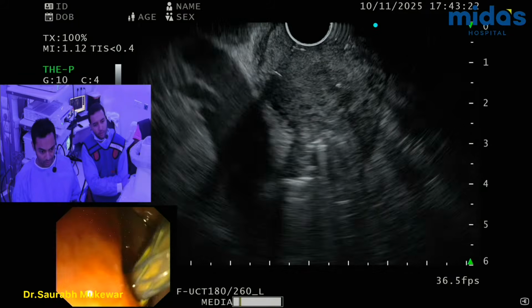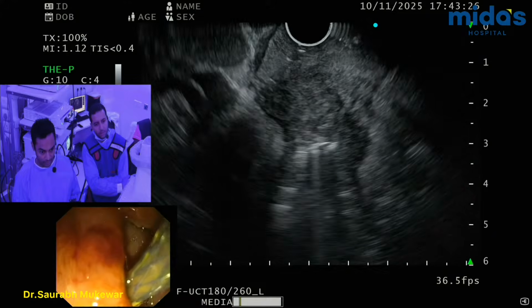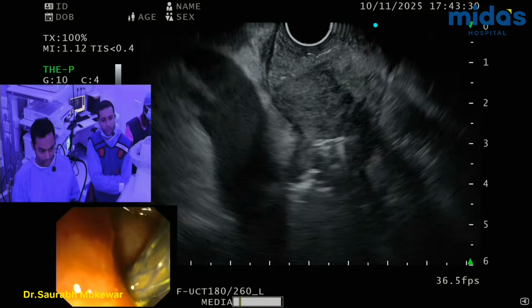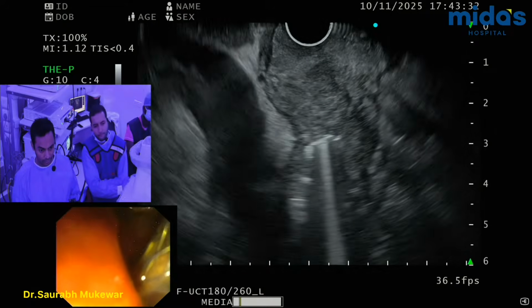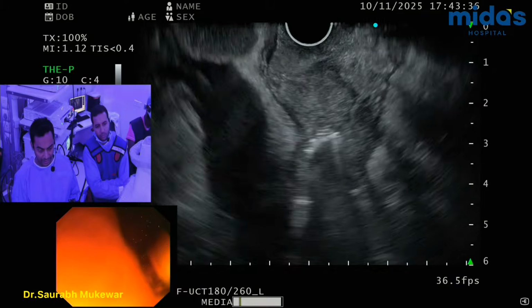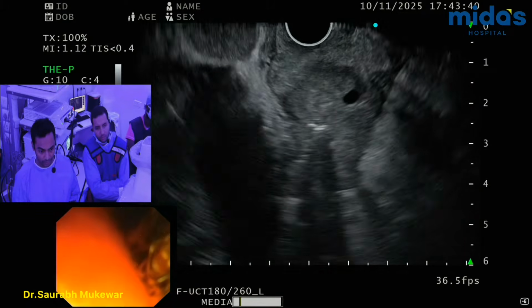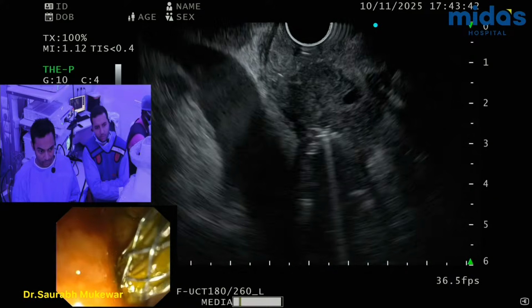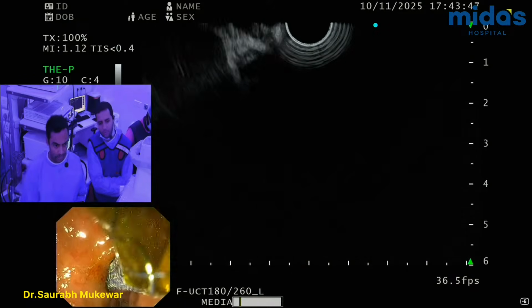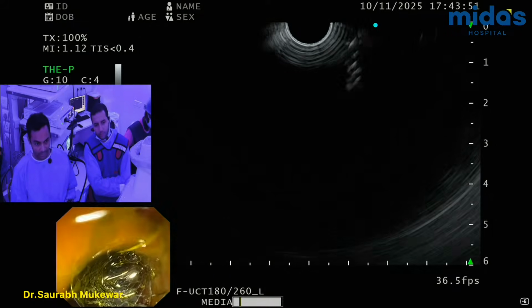Okay, very nice. Keep going. Yes. Keep going. Okay, stop. 50% done. Okay, very nice. This is good. Okay, ready? Keep going. That's a CHD, no? Perfect. Keep going. CHD is very high up. Keep going. Keep going. Lovely. Done. Perfect. Ooh, sludge, yeah. Pus. Alright, fine.